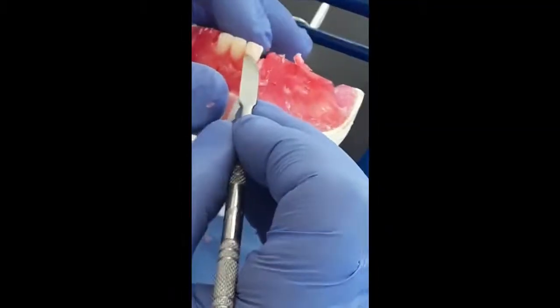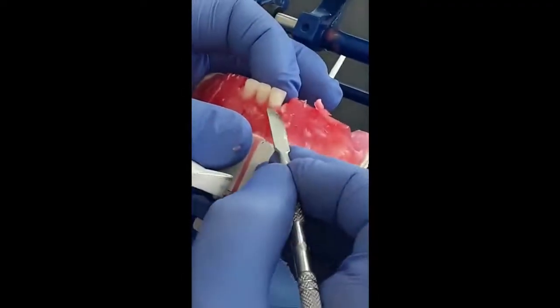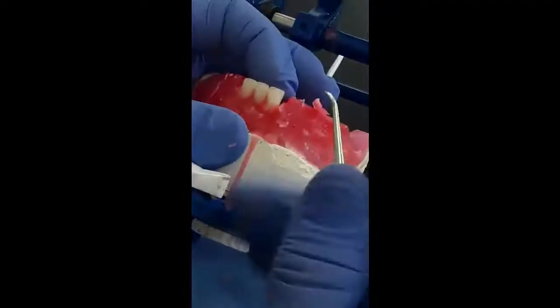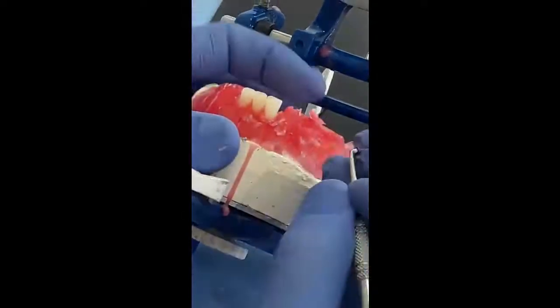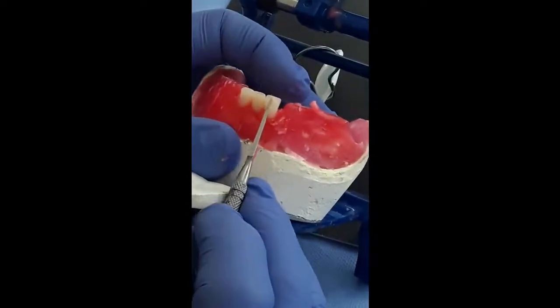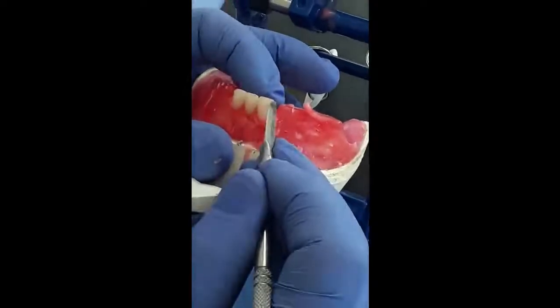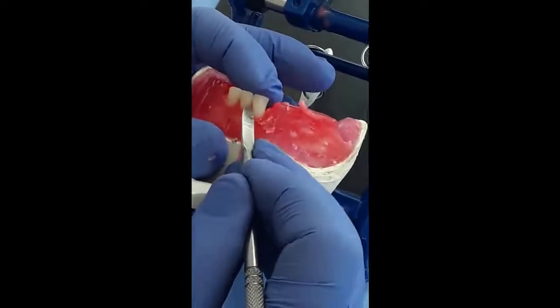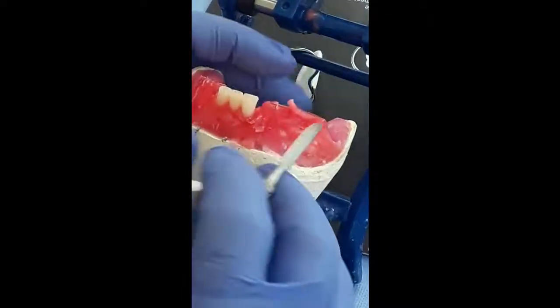Once we establish the height of the teeth, we can follow the same height, and that can give us the same incisal guidance angle. Here, as we mentioned, the long axis of the lateral will be slightly inclined to the distal at the neck area, while in the profile or proximal view, it is vertical.